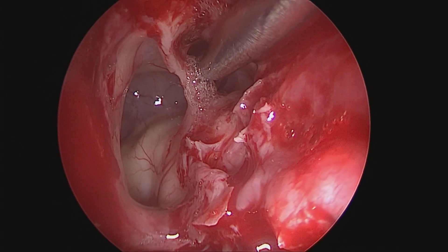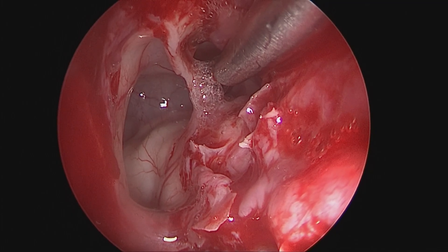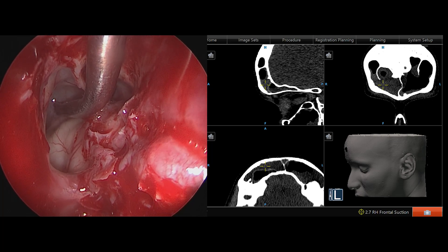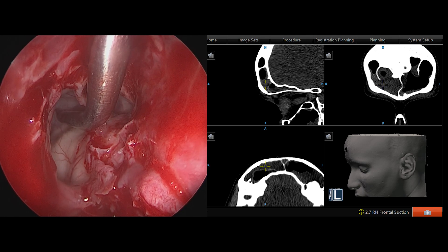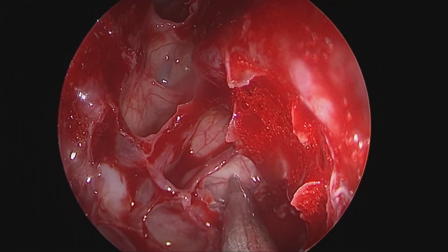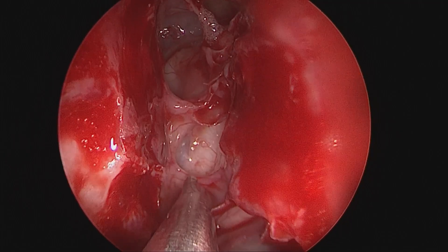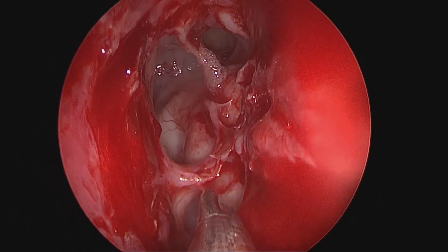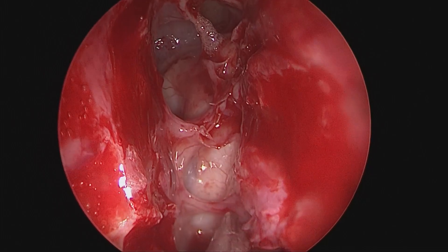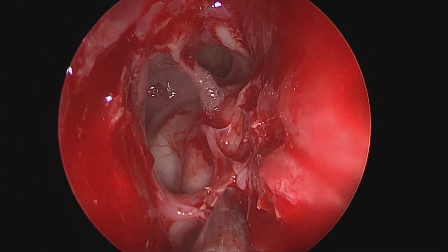The navigation suction tip is pointing inside the erstwhile interfrontal sinus septal cell, the lateral boundary of which is the bony septation dividing it from the frontal sinus proper. We then take the suction navigation inside the frontal sinus proper, seen on screen as the cursor pointing in the frontal sinus on all three sections — coronal, sagittal, and axial cuts. Taking the 70-degree scope and viewing the skull base, we can see the complete skull base from posterior to anterior, including the ethmoidal vessels very clearly.